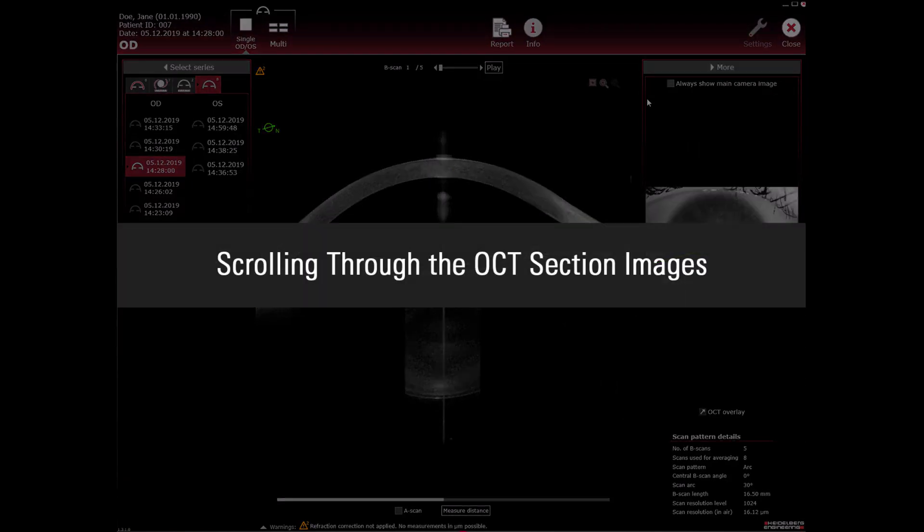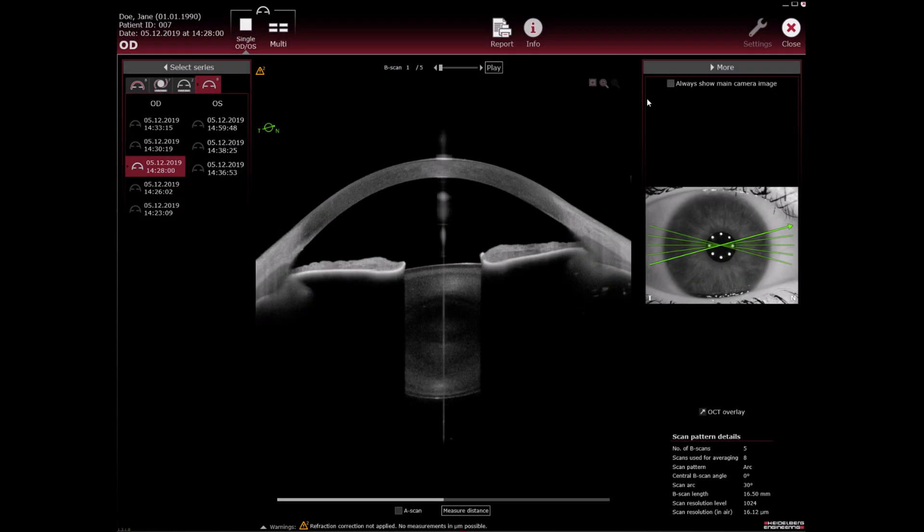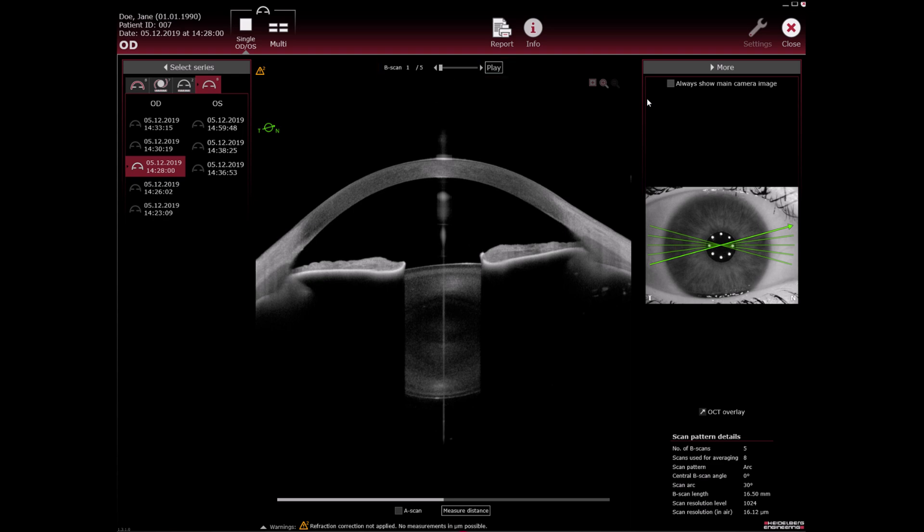Scrolling through the OCT section images: The slider above the OCT section image shows the number of OCT section images and the currently displayed image. To scroll through the OCT section images, use the B scan slider.